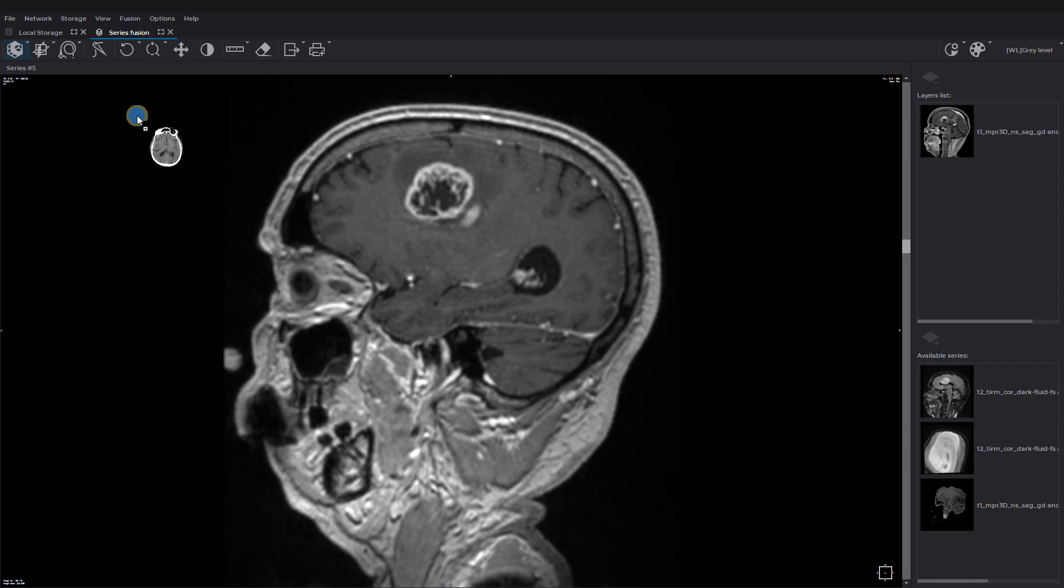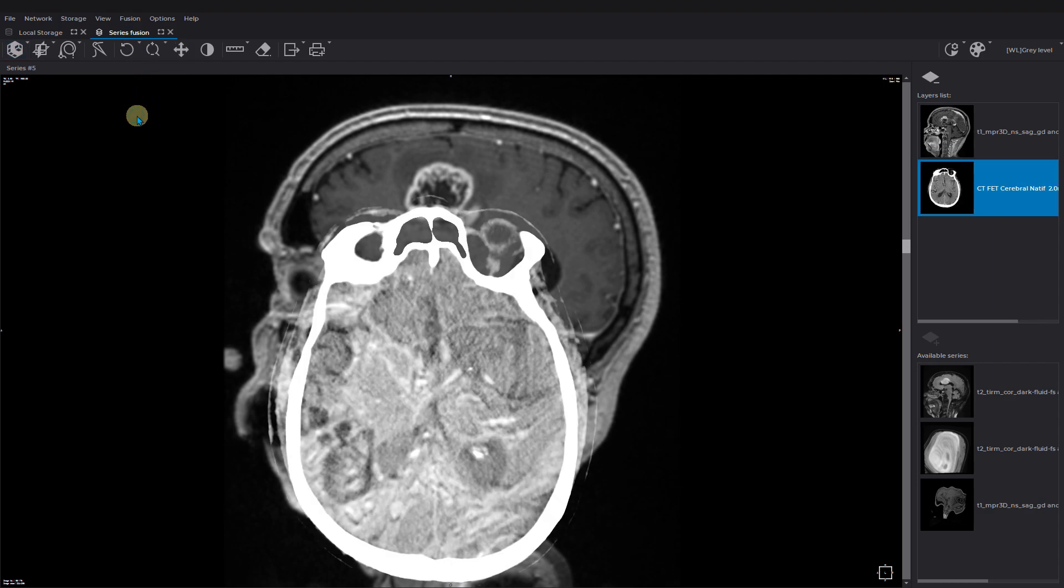You can open the merged series in 3D, multiplanar reconstruction, or virtual endoscopy window. Let's open the merged series in the MPR mode.